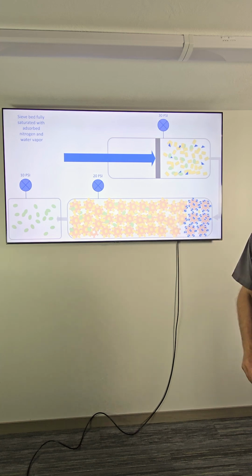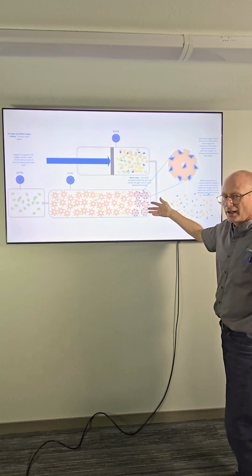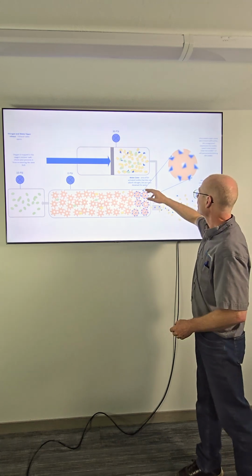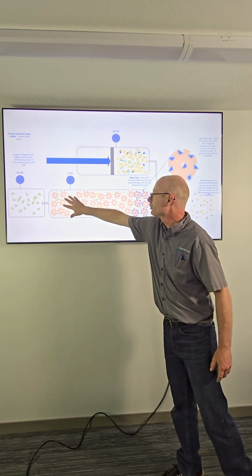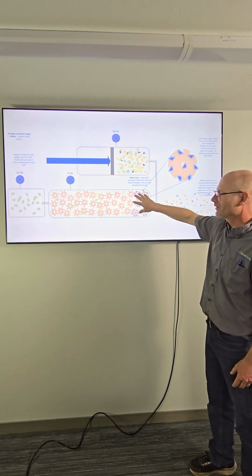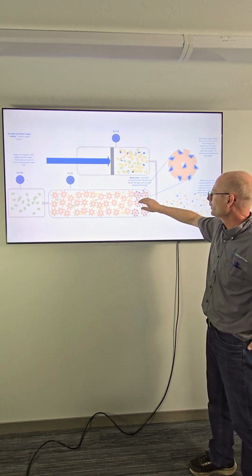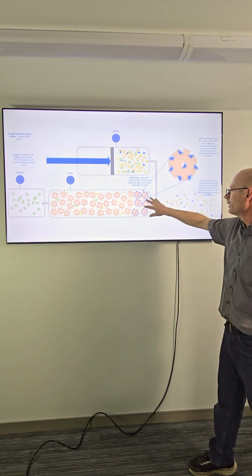So now once this is full, we open a valve at the end. This was under pressure, and now all these nitrogen molecules, you can think of them like they're stuck in their little spring. They release. This pressure forces all the nitrogen out, and along with it, it carries these more weakly bonded water vapor molecules. So at first, in the last slide, there were two of them shoved into every little space, but this nitrogen rushing out removes a lot of it.